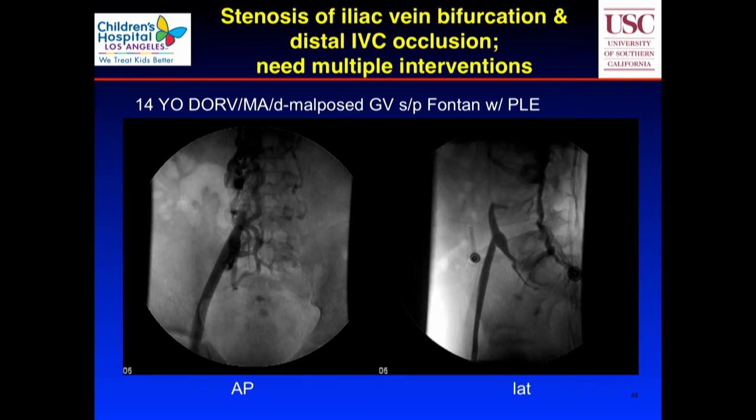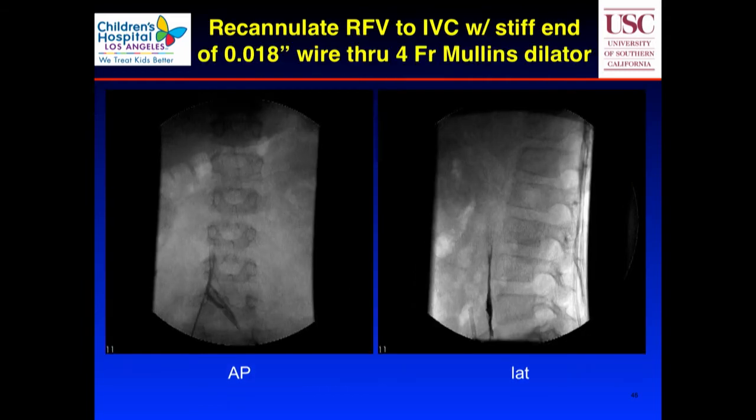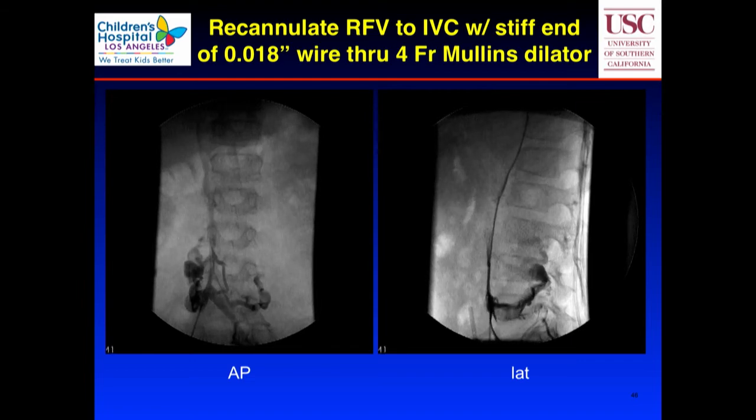All right, so here's a patient who has a Fontan. Again, these are patients with very complex heart disease with a single ventricle. Obviously, these kids need a lot of help. And we find these kinds of problems where the IVC is gone. See how the blood vessel just can't find its way up there. It's totally gone. And you can imagine the kids don't feel very good because the legs are always swollen.